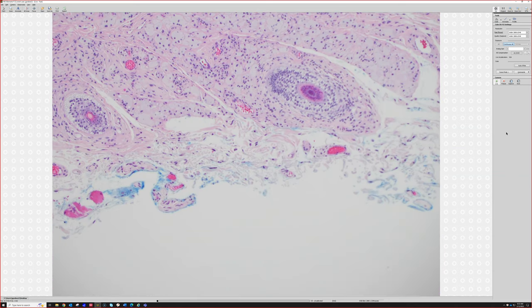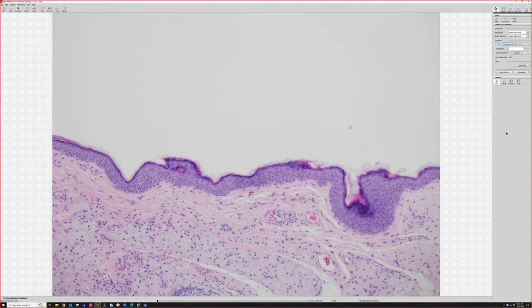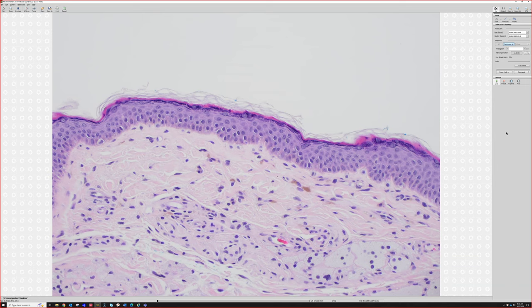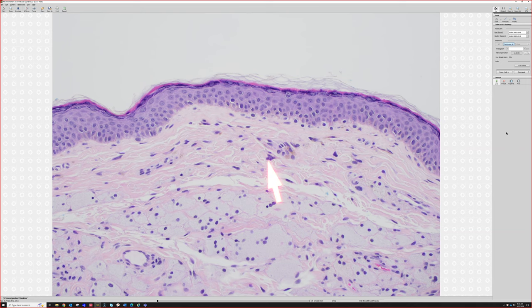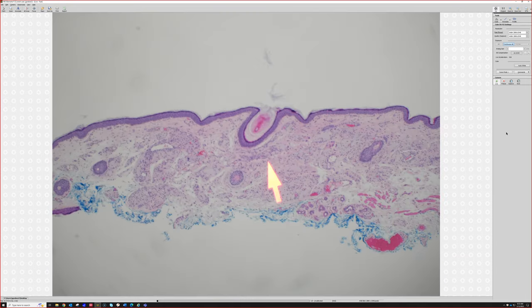But it is so reliable that if I see skeletal muscle, loose edematous dermis, some kind of stellate multinucleated cells in the dermis, see like right here, these little cells, I don't know why, but these kind of stellate or triangle or multinucleated cells, that's not the best example. Maybe that's a better one. They are common in eyelid skin. I don't know why. And then pigment dropout. Those things together, I'm going to tell you it's eyelid skin. And I will be right most of the time. Okay. Xanthelasma.